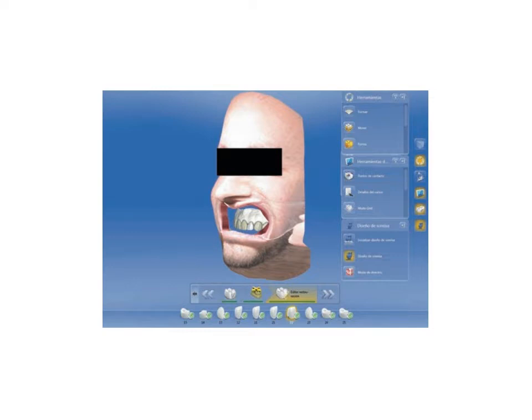In conclusion, the digital smile design is a concept of diagnosis and reversible planning, susceptible to modifications of clinical cases during the execution of the treatment. It contributes to improving the communication among the members of the patient care team, such as doctor and technician. In addition, it facilitates communication between the dentist and the patient. The digital smile design is a valid tool for documenting and archiving clinical cases in an orderly manner.